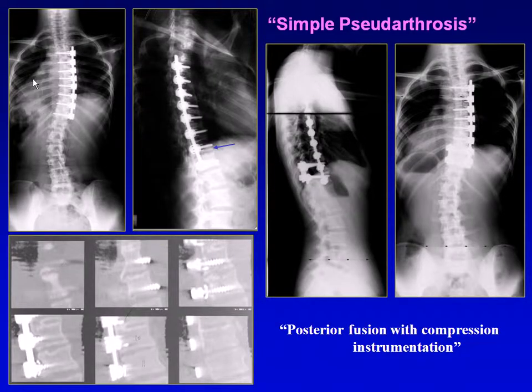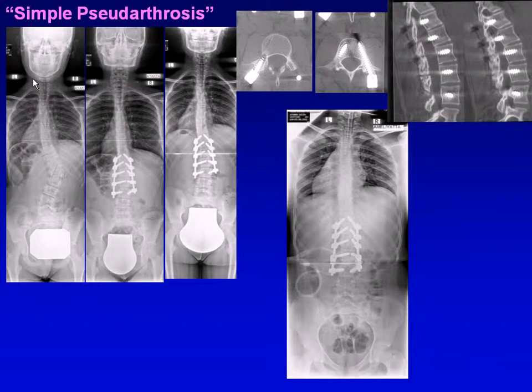This is a complication case. We have performed anterior surgery, selective thoracic fusion in this case. Now this is a case of 1-level pseudarthrosis, and we did just posterior 1-level fixation and graft augmentation. The other case, simple, we have performed selective fusion in the Lenke type 5 curve.